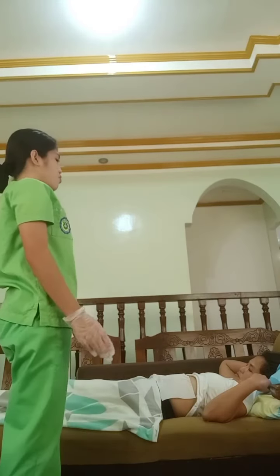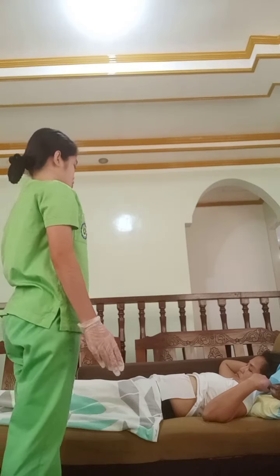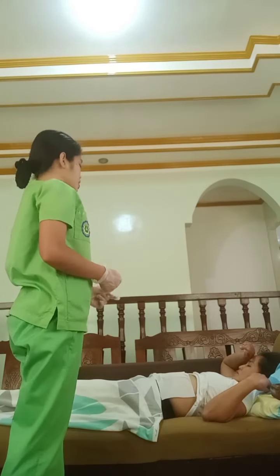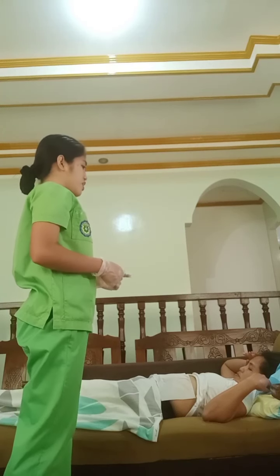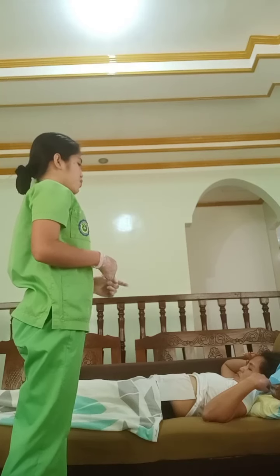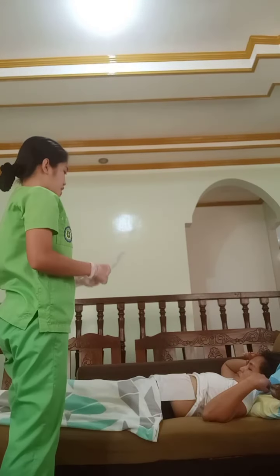And then next, for easy succession of the procedure, we must prepare the equipment needed. Of course, by using the size guide, we will determine the size of the stoma for the new colostomy pouch. So this is the size guide.